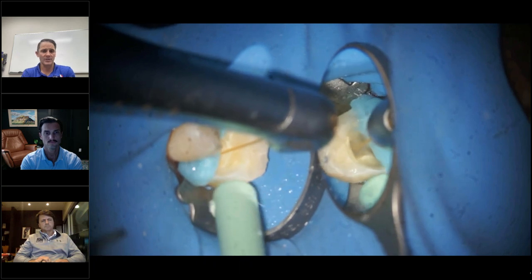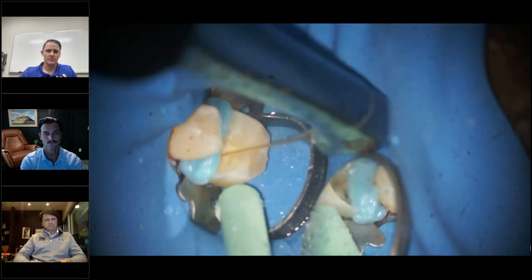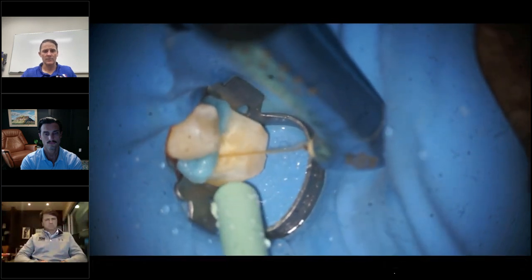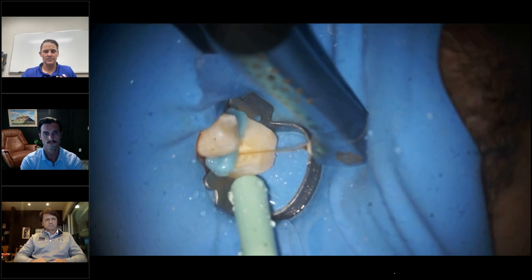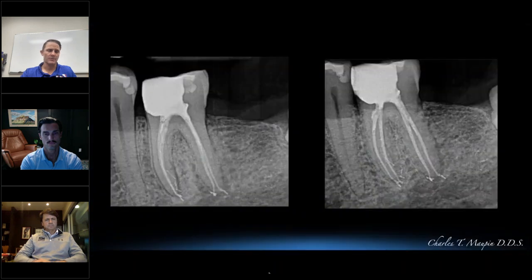So now we're coming back in doing our final coronal conditioning. I just left the number 1 tip on here. I do this for about a minute. We come in and I just hold it, roughly orifice level, kind of move it around in the chamber, flushing everything out. Angling towards the other mesial canals. And then after that, we're ready to aspirate and dry.